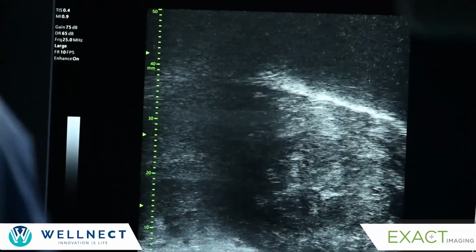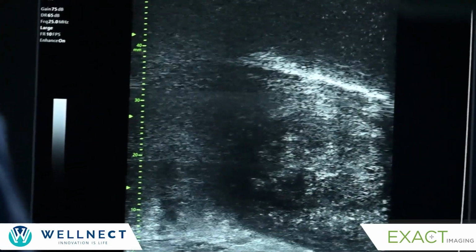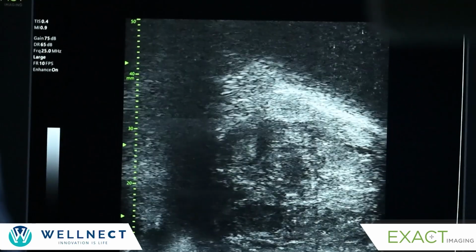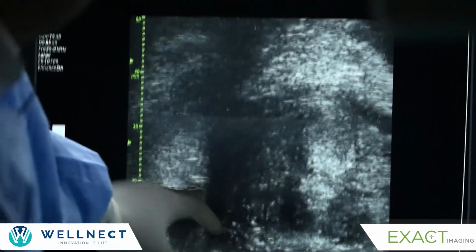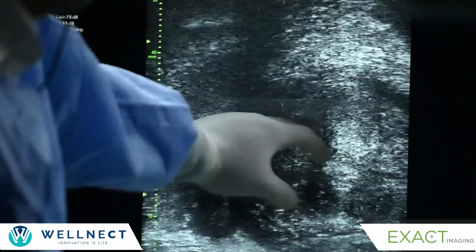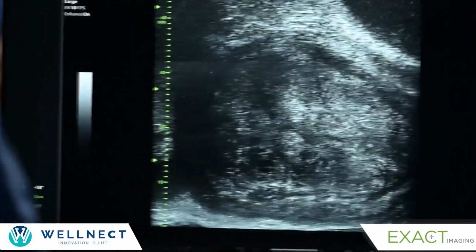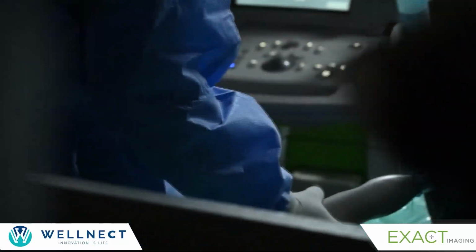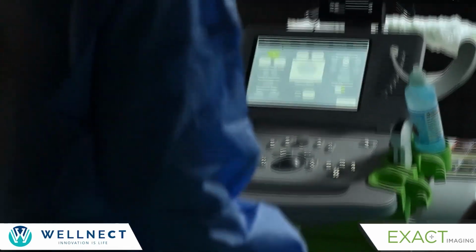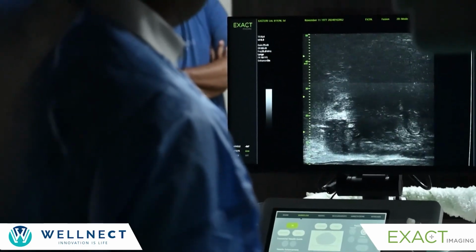So this is the extreme right end of my prostate. Now I am scanning clockwise, to orient you. This is the bladder base. This is the bird beak side. This is the seminal vesicle, and this is the prostate. Now you can definitely see this lesion. Now I am going clockwise. Now in the midline, I see this catheter, and once I see the catheter, that means I have crossed the midline. I am going toward the left side of the prostate, and now the prostate finishes on the left side.